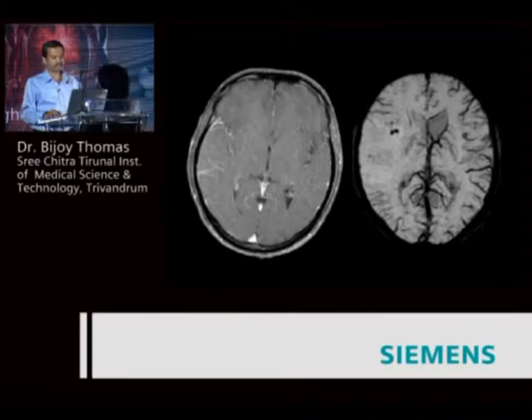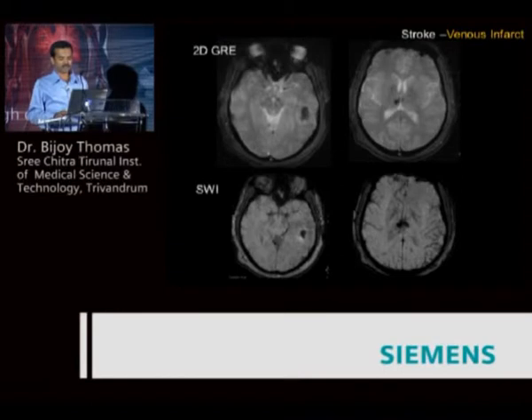What does that mean? From our previous experience and papers from AJNR, we know that early reperfusion is actually considered to be a bad thing because it can actually bleed. So this is exactly what we detect in SWI. You can see that the blood products are already happening in this infarct. Although these are preliminary anecdotal findings, the exact clinical validity has to be validated further.